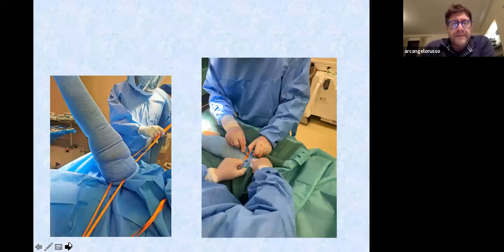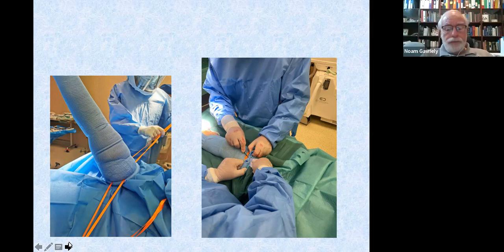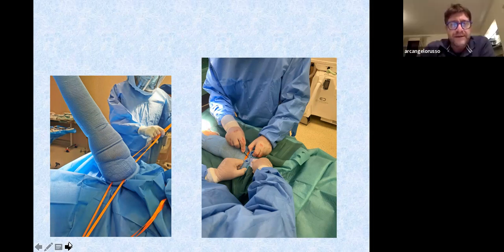This is my experience directly. As you can see, you put the drop and the silicone ring. After this, you have to cover the HemaClear with a new sterile drape. You see the green one, because when you cut the silicone ring, the surgery field has to be sterile.